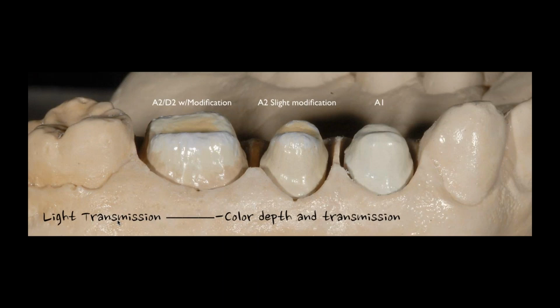And by the way, I stain and glaze too. Of course, we have certain cases and doctors that we do stain and glaze molars for. And let's be honest, they're getting better and better looking. So I'm not poo-pooing stain and glaze and monolithic molars at all. But I do want you to understand that if you really want to create depth, that depth comes from the inside and working from opacity to translucency.